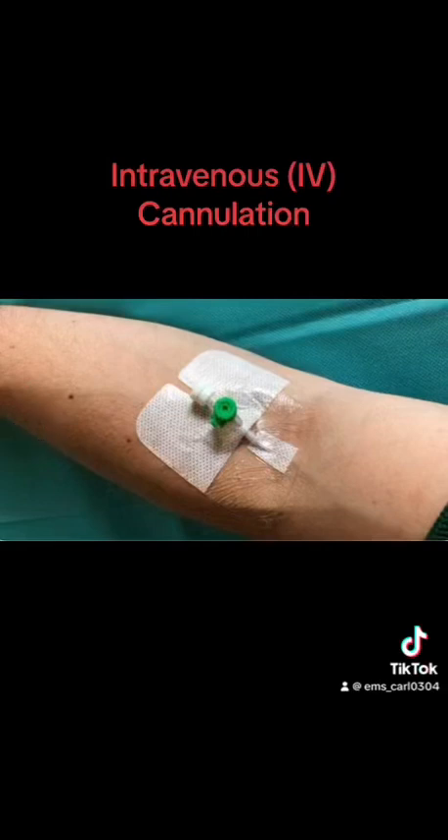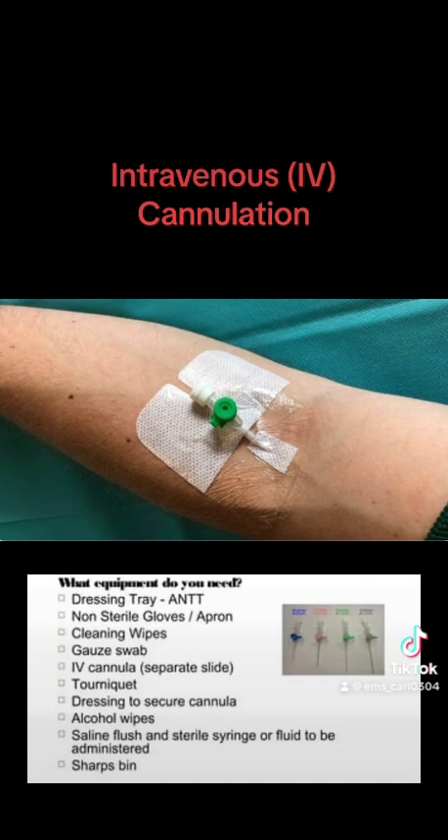Hello and welcome to our IV cannulation insertion mini clip. Let's begin with step 1. Make sure you have all the equipment to hand ready to cannulate. Choose an arm to cannulate and see if the patient has a preference. Keep in mind pre-existing medical conditions may prevent you using an arm. In most cases it's the patient's non-dominant arm that is used.